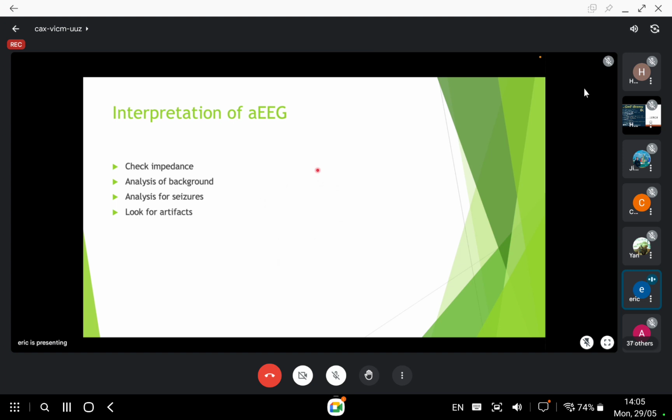Anyone has any other machines? We have the Natus NeuroWorks, as I've mentioned. I think HDF also has the NeuroWorks, and Langkawi has the Olympic Brainz. Not sure what other brands are being used in the other hospitals.